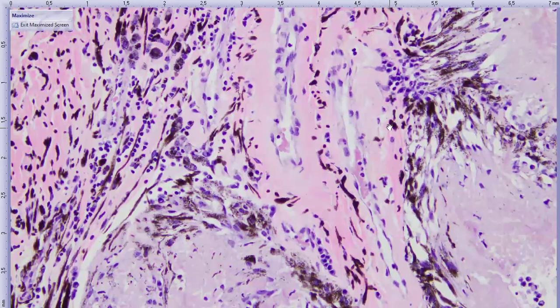That said, it's worth noting that there may be some overlap between the amyloid carpet and other diagnoses in horse eyes, like heterochromic iridocyclitis, which is a more recent thing that's been published. So we're still interested in looking into some of these things. Maybe the amyloid carpet may not be as specific as we once thought, but at least currently, if you're being tested on it, for example, the key diagnostic features for ERU are the amyloid carpet plus or minus linear eosinophilic inclusions in the non-pigmented ciliary body epithelium, plus or minus lymphoplasmacytic anterior uveitis. That's the classic. So this is a classic case as far as we're concerned.